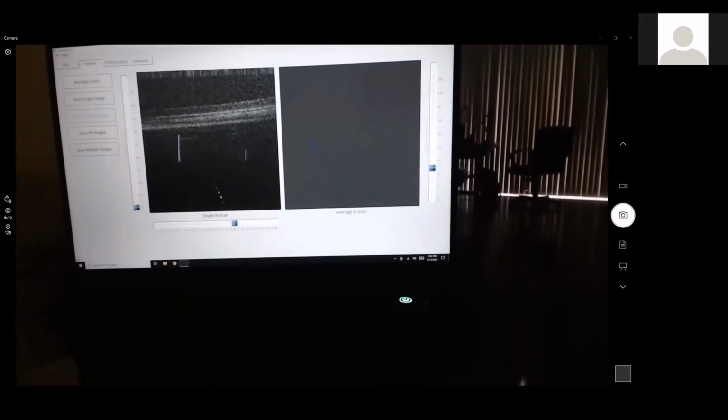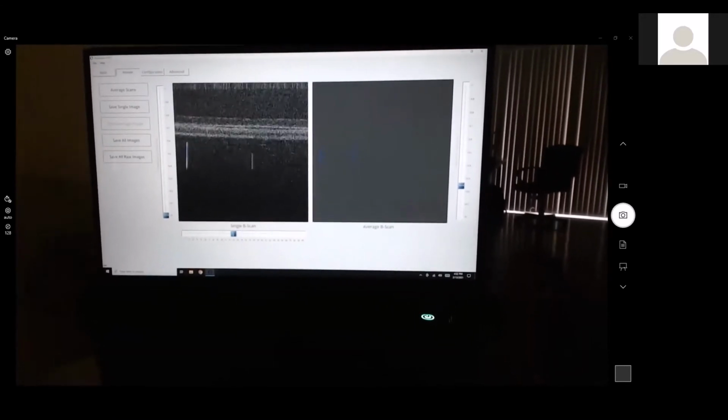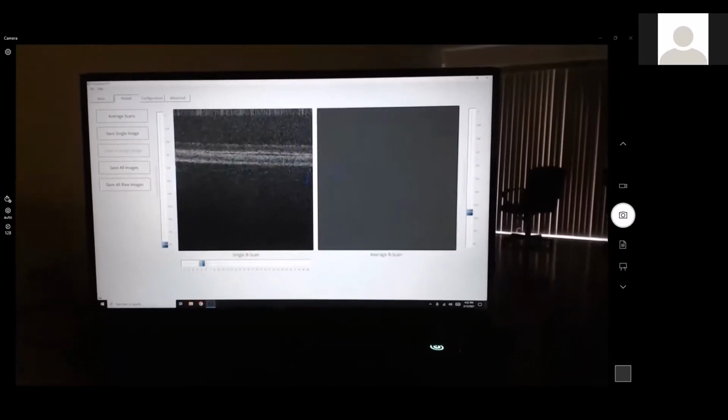So as we can see, we did the cross scan on the retina as well. So when we review the images we've captured here, we're getting that same kind of teeter-totter effect. And that's, of course, it jumping back and forth from horizontal to vertical scans in here as well.